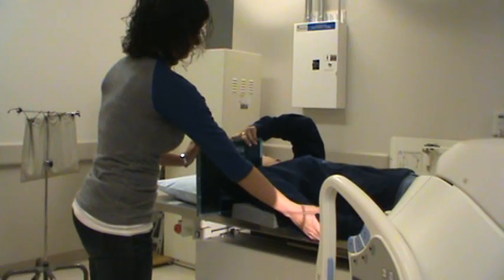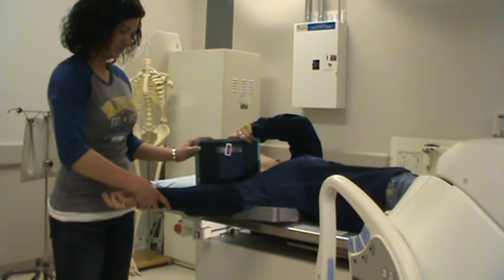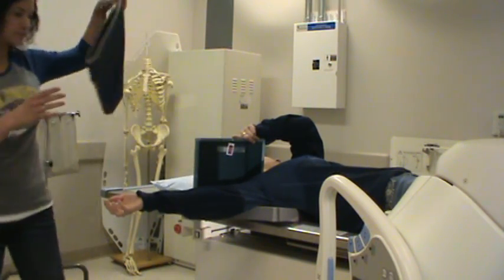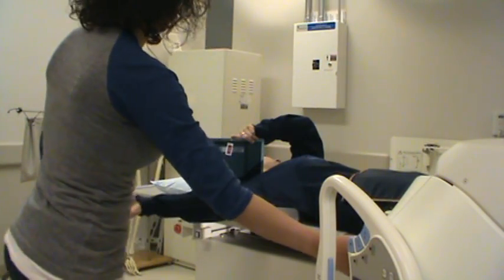Abduct the arm 90 degrees away from the body if possible. Rotate the arm externally with the hand supinated. Shield the patient, and suspend respiration on exposure.